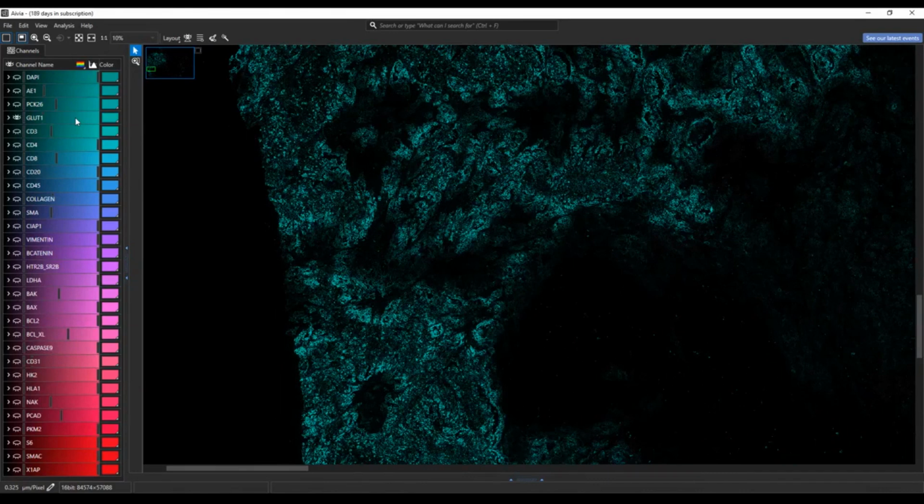This tissue area also has areas of low GLUT1 expression here. And so I think if we optimize the cell detection recipe here in both high and low GLUT1 expression, we'll get a recipe that's going to work well for the rest of the data and allow us to detect the cells in this whole tissue. So let's get to that step.